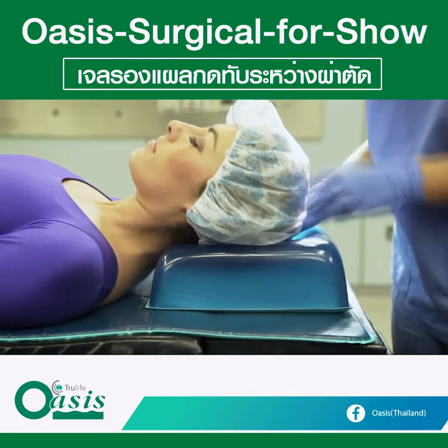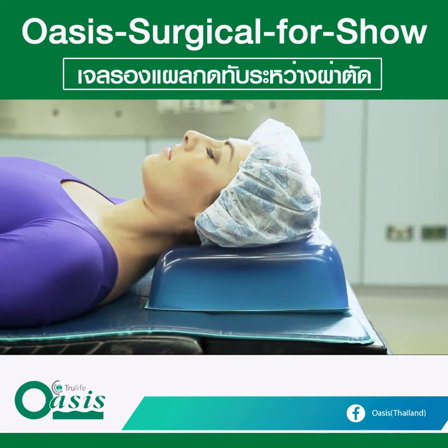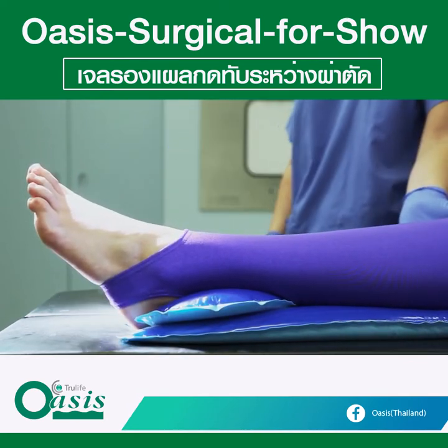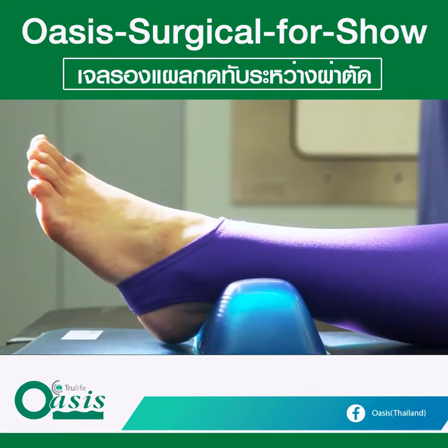Occipital pressure ulcers can cause alopecia. For ENT and ophthalmology procedures, a headrest with more lateral support is often required. Heel rests are also designed to lift the heels free of any pressure. In many studies, heels are the second most likely pressure ulcers to be observed.